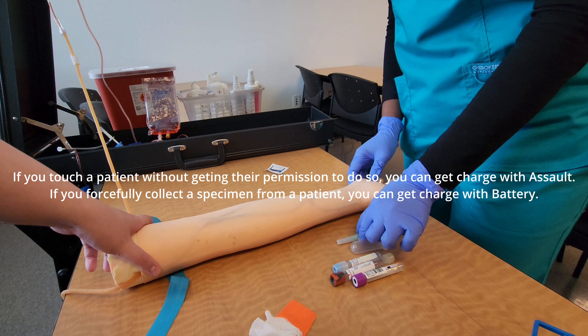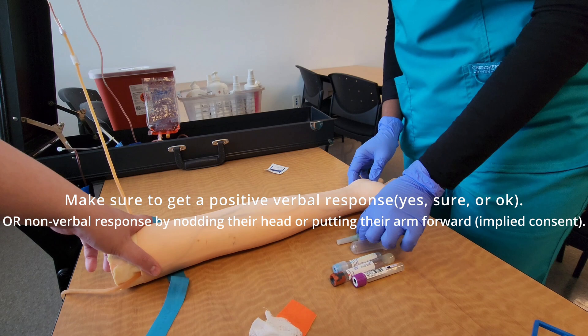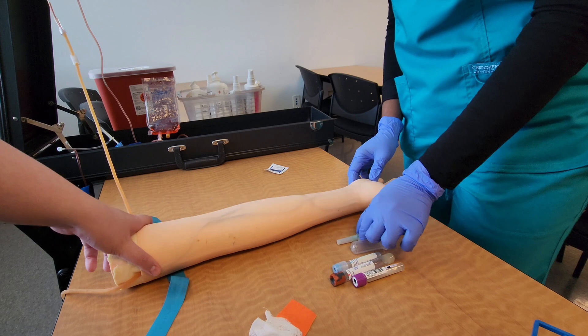So you want to ask them: 'I'll be performing this procedure — is it okay for me to go ahead?' If they refuse, go to your supervisor and let them know the patient has refused. The supervisor may come in and talk to the patient, and if they still refuse, there's nothing you can do. They'll have to call the doctor's office and let them know the patient doesn't want their blood drawn. Once the patient gives a 'yes,' the next step is to proceed.